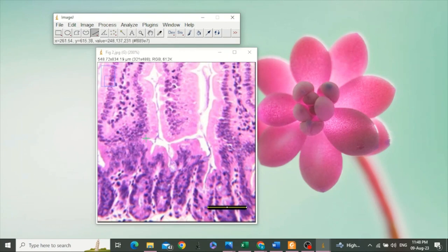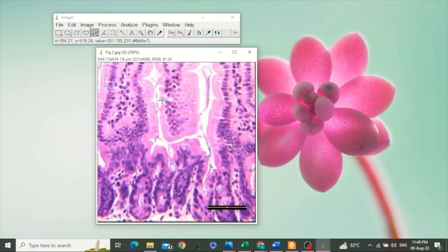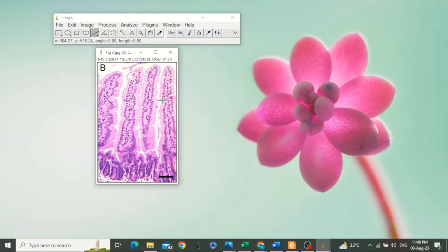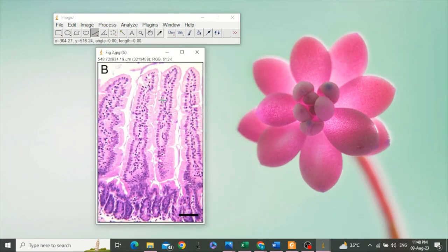This was the second method to calibrate ImageJ. Now ImageJ software is calibrated. Now zoom out. Okay, after the calibration of ImageJ, we can take its measurements by using the same tool.